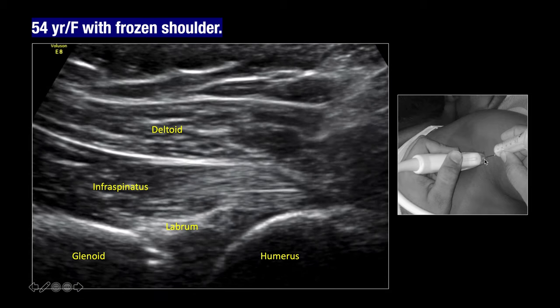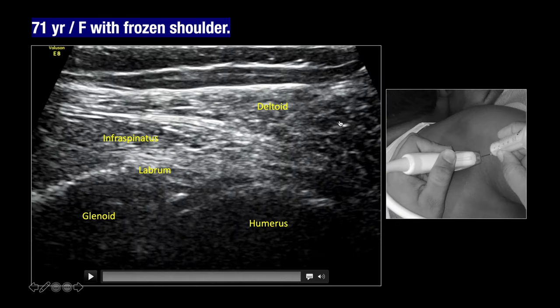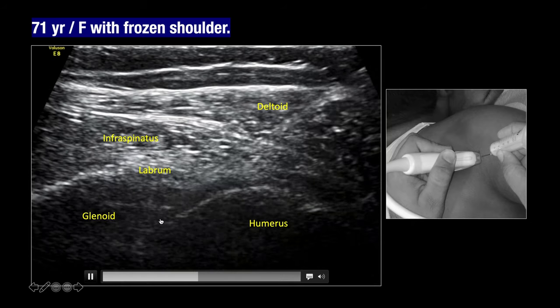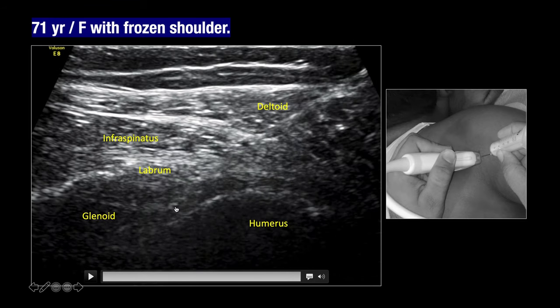The patient is positioned prone and you go from lateral to medial. In a 71-year-old female with frozen shoulder, the pre-procedure radiograph is unremarkable except for mild acromioclavicular joint arthritis. The patient is positioned prone with the arm abducted, and as you go from lateral to medial, the needle enters the joint. Once the needle is confirmed within the joint, you gradually inject the injectate and see distension of the joint or small bubbles as it enters the joint cavity.